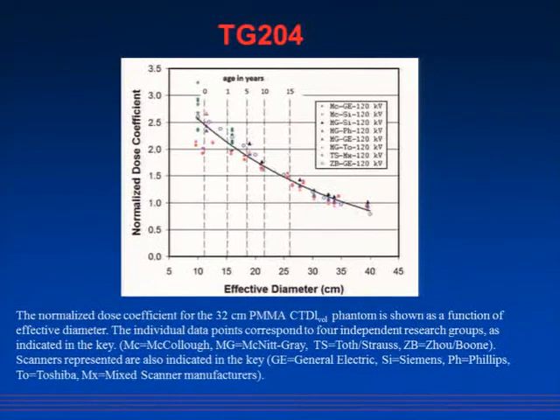So it's a very nice number to know. It's still a simple number. It's not a detailed computation, and the tables are very useful inside of this. This turns out to be a really good way to think about what's going on with patient dose.